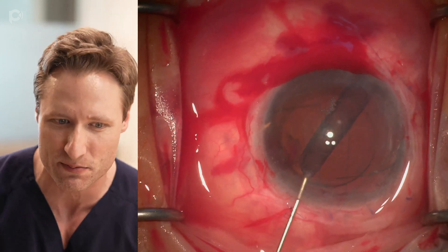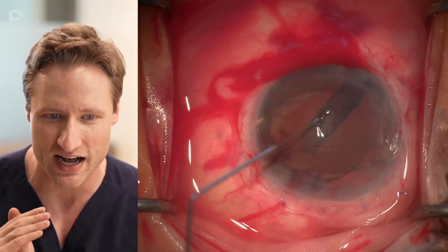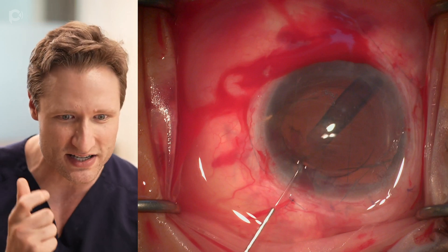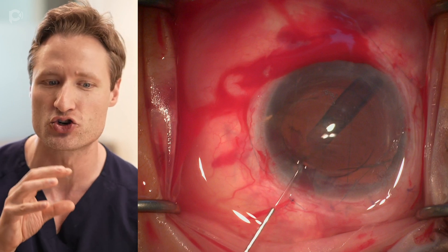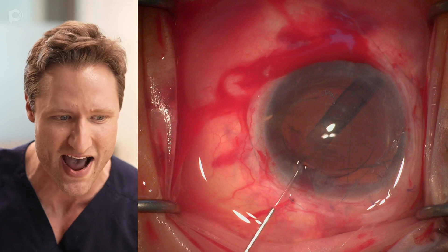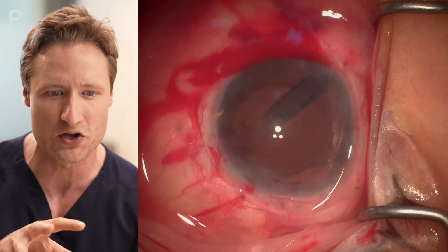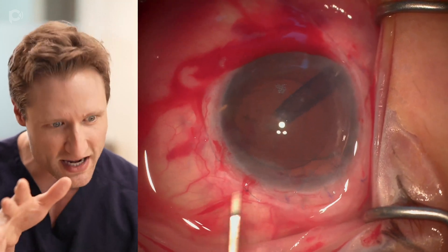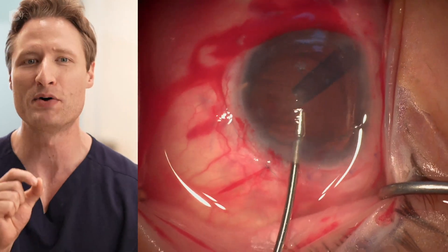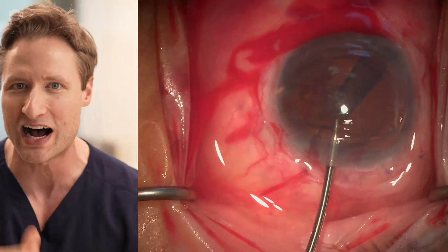Already the graft is starting to dive into the back of the eye. I'm injecting fluid because one key mistake you don't want is a hypotonic eye — if the eye is hypotonic, the graft gets sucked into the back of the eye behind the IOL. You'll notice that even though I'm injecting saline, the eye is starting to shrink and shrivel. As it collapses, that graft is being sucked into the back of the eye around the edges of the lens, and I don't have the protection I need because I didn't make enough passes of the suture webbing. I noticed the graft starting to deep-six, and I'm trying to inject fluid to resist that suction. But I'm already missing part of the graft expanse — it's teetering on the edge of the lens. So I'm going into the eye with these coaxial forceps to try to grab the graft and drag it open.